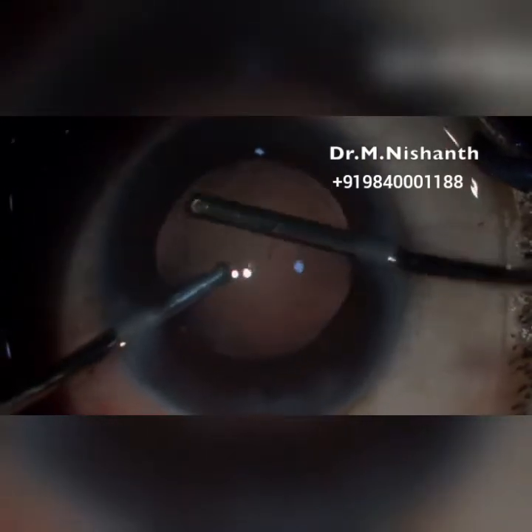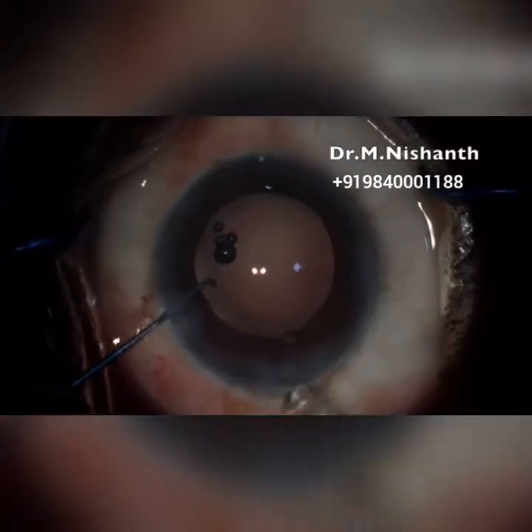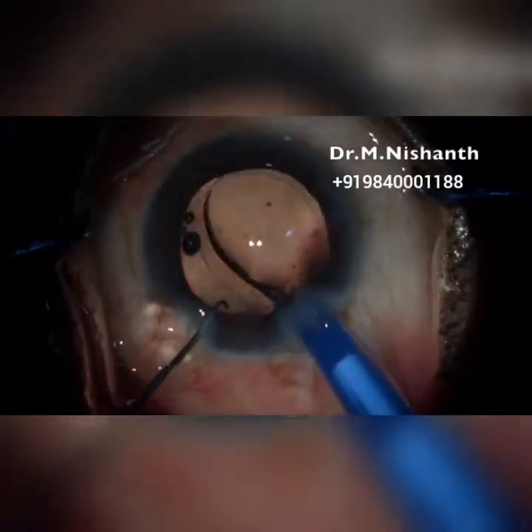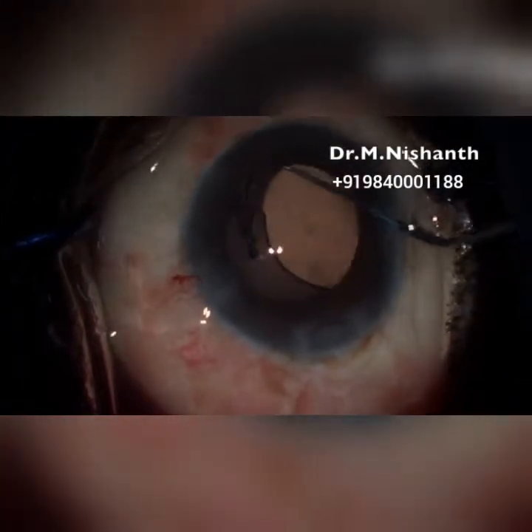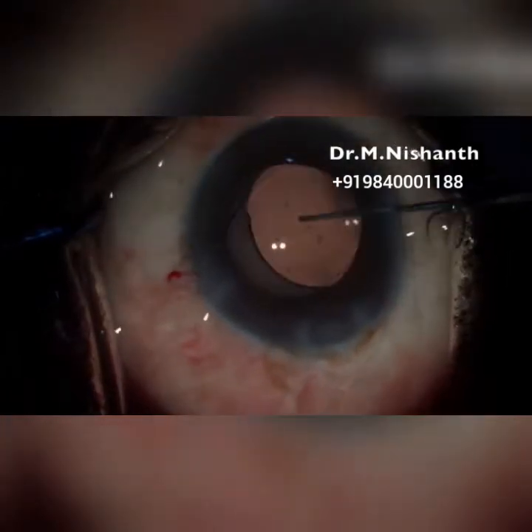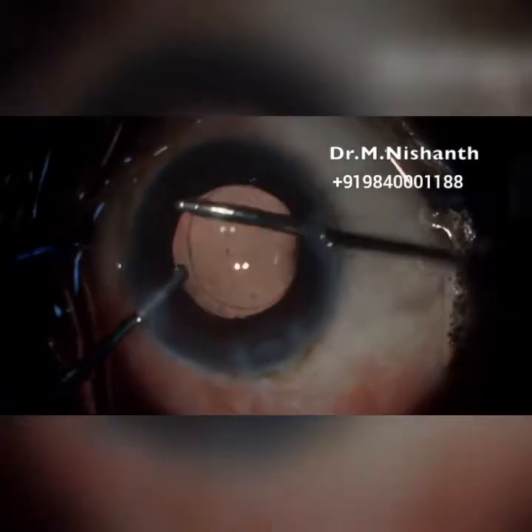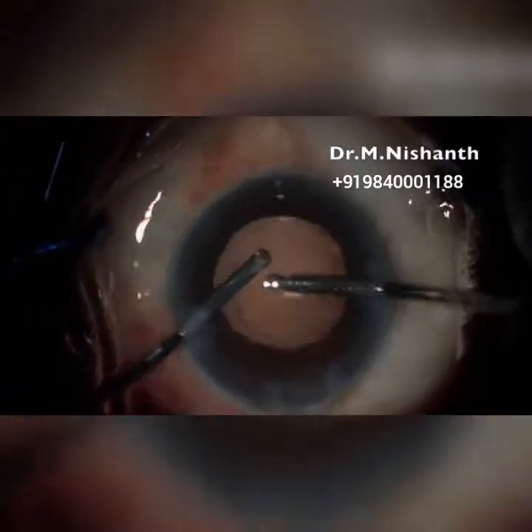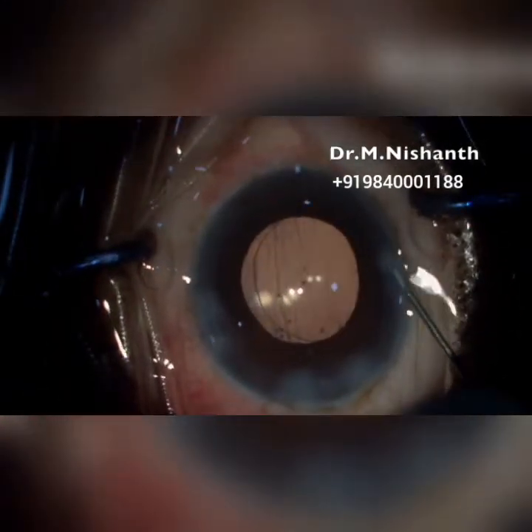The posterior part of the anterior capsule margin is washed. A foldable posterior chamber intraocular lens is placed in the bag and dialed. Make sure the viscoelastic is washed from the anterior chamber and behind the IOL. The integrity of the bag and the stability improve to a great extent with the zepto.